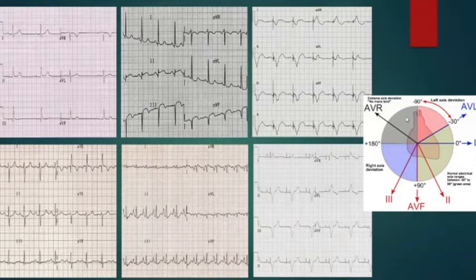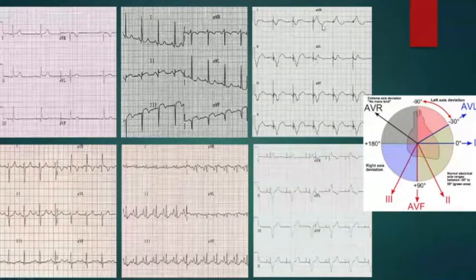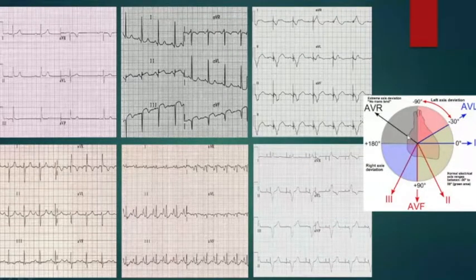Can somebody try? This is even something other. It's going to that quadrant because the signal is going from the left ventricle backwards, because that's not the usual type of pacemaker. This is a cardiac resynchronization therapy device, which has two electrodes: one in the right ventricle, usually in the apex or the lower septum, and one in the left ventricle. And that's why the axis is going that way.